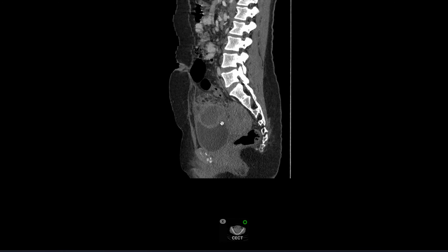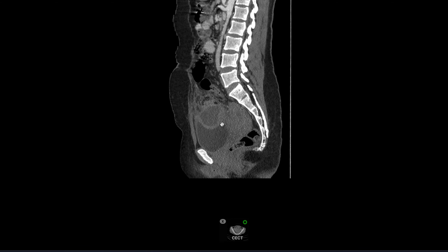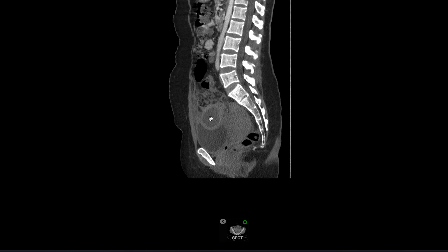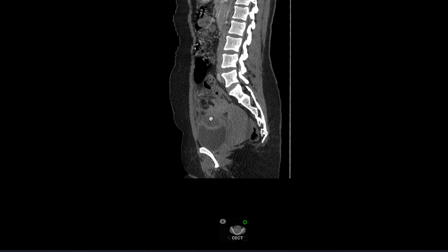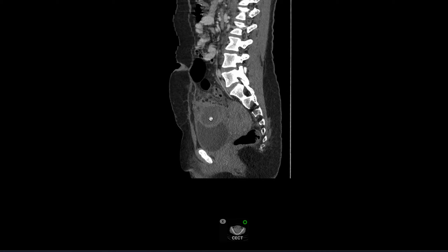This is the abscess which is seen very near to the anterior abdominal wall in the left paramedian location.